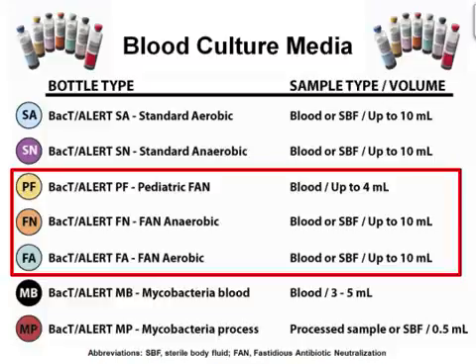Each contain 40 milliliters of supplemented tryptic soy broth and can be dosed with up to 10 milliliters of sterile body fluid or blood. Like many other methods of pathogen detection, blood culture has its disadvantages. One disadvantage is that antimicrobial therapy has been shown to reduce the effectiveness by 71.8% in spiked blood samples. Therefore, blood culture sample collection is recommended before initiation of antimicrobial treatment. This is not always possible in critically ill patients, however, due to high risks of mortality associated with delayed treatment.